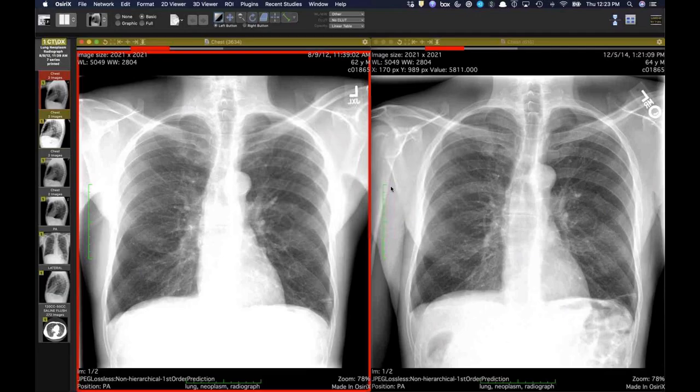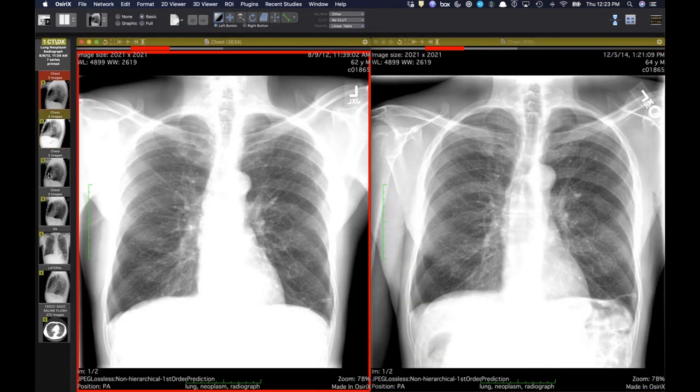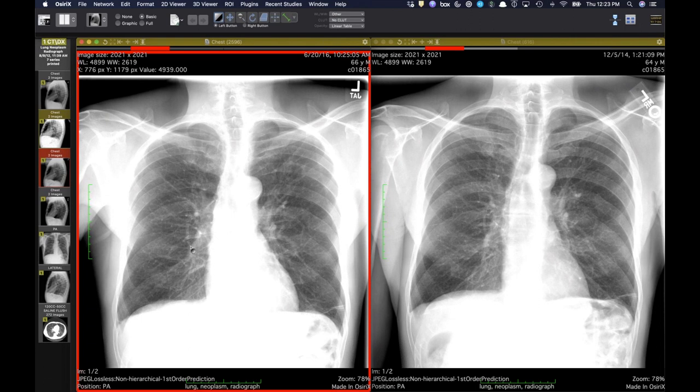Okay. Do you see my screen here? Yes, we do. This is just an eye test, and it shows how long things can be present until they're detected. So this is the original radiograph. This is 2 years later, and you know, not really much there. I'll pull up the next one here. And this is 2 years after that. You see any subtle lung cancer developing?